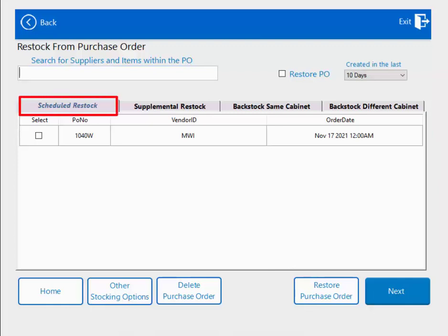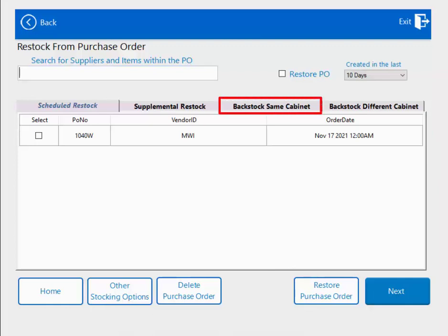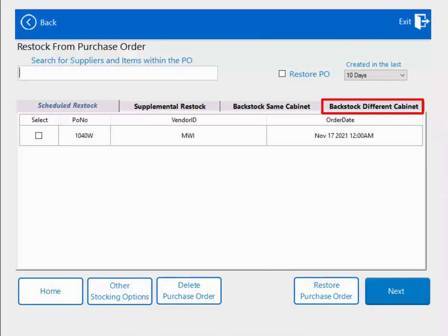The first tab is for a scheduled restock — this is when a supplier purchase order is waiting to be replenished, for items that either do not have a backstock or for replenishment of backstock inventory. Scheduled restock purchase orders are set up in MyKeyLink under the purchasing tab. The next tab is for supplemental restock, used when restocking outside of a purchase order. The backstock same cabinet tab is when backstock and active stock are in the same cabinet, and the backstock different cabinet tab is when backstock is in one Qubex cabinet and active stock is in another.